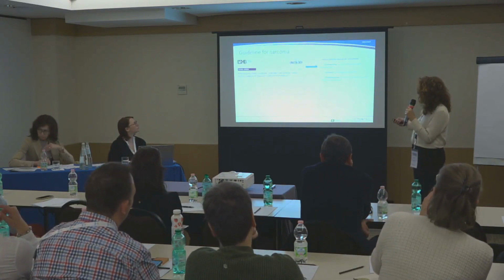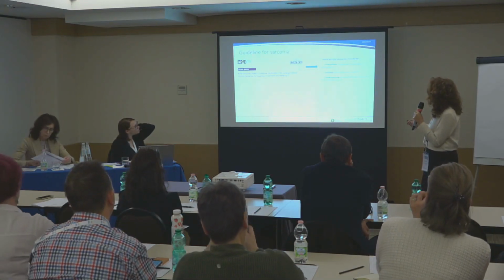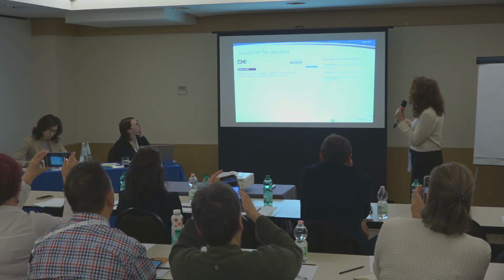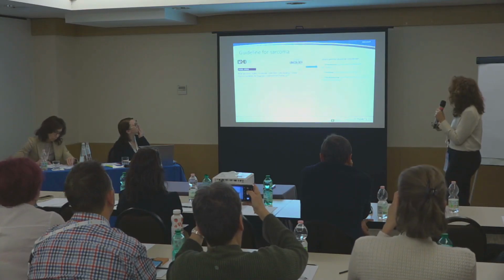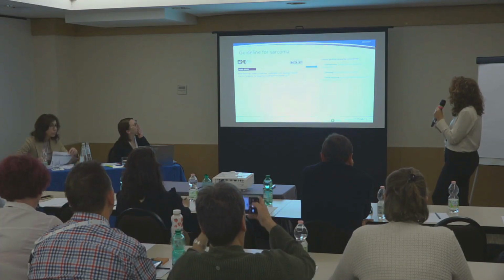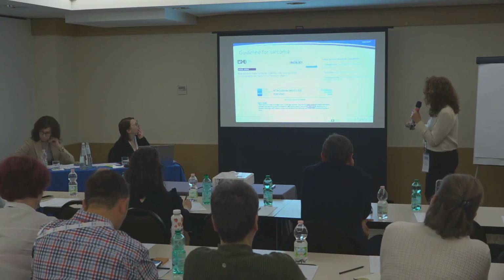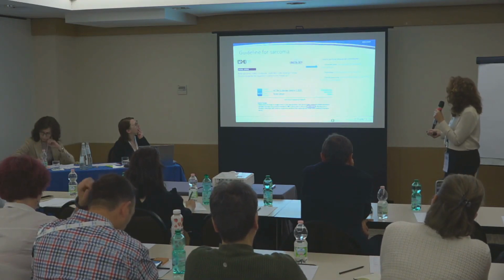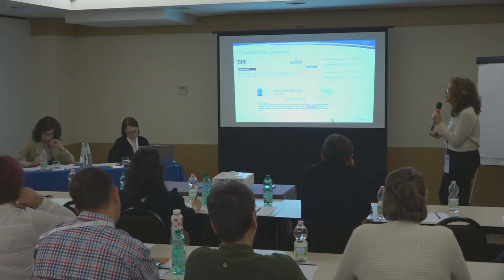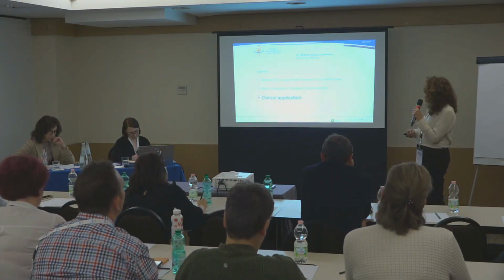So the indication is recognized in European guidelines. This is European ESMO 2021, where all of them recommend heavy particles should be considered for all three radioresistant histologies, mainly for unresectable tumor. In the NCCN guideline, so in the American guideline as well, we see a recommendation with protons, carbon ions, or other heavy ions. So, some clinical applications.